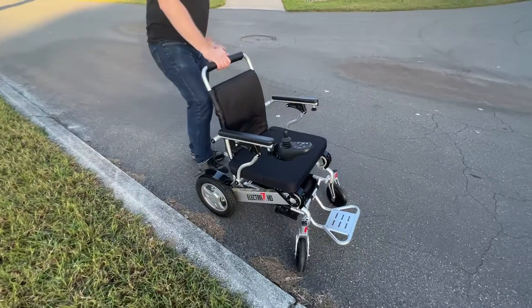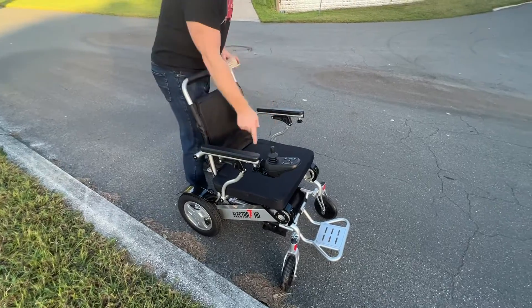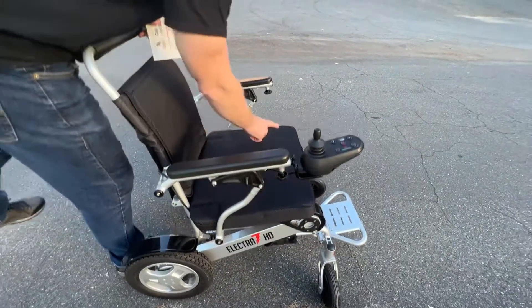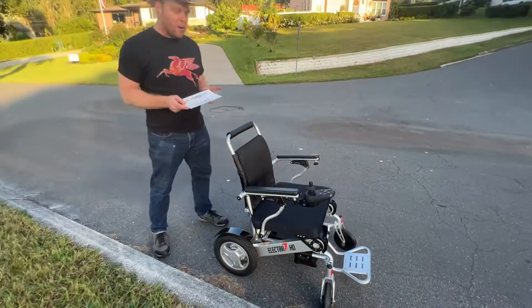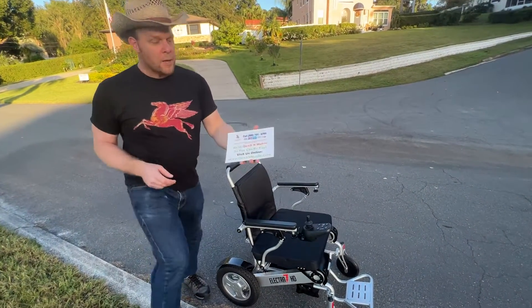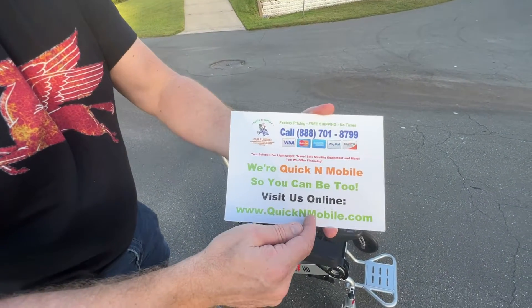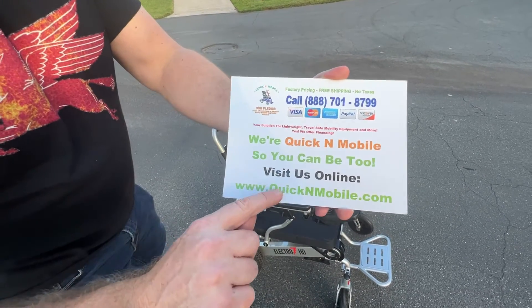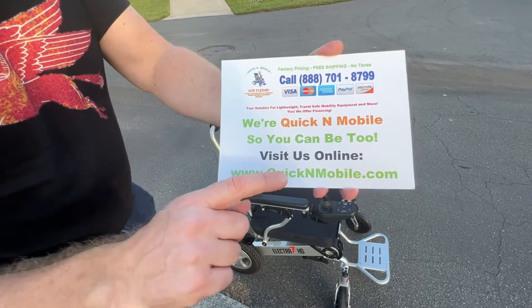We are going to test this with the Electra 7 Power Folding Wheelchair. This has approximately 21 inches of space between the armrests, a 20-inch wide cushion, holds up to 400 pounds. With the armrest spacer kit, you can have approximately 24 inches of space between the armrests. There is one place to find all the information you'd want about the Electra 7 and other chairs: QuickNMobile.com. You can call us, plug it into your web browser on your phone, or directly on your computer.